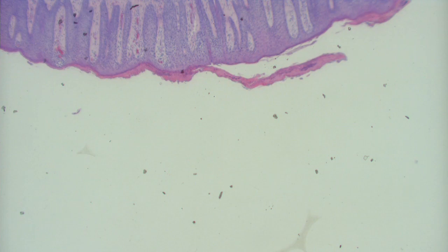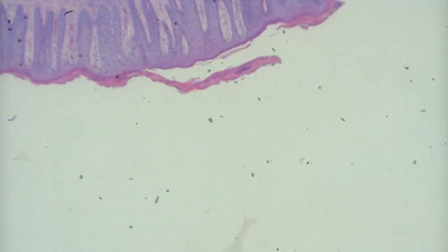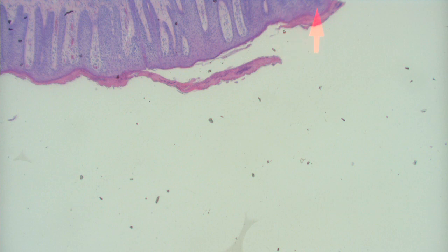The stratum corneum, there's whether it's parakeratosis or something. Yeah, there's parakeratosis. It contains neutrophils. What about the granular cell layer here? It's nearly absent. It's gone. Good. But there's also inflammation, and then over here there's some spongiosis.